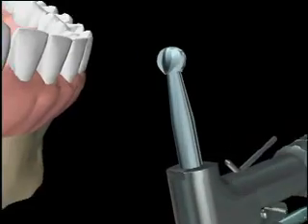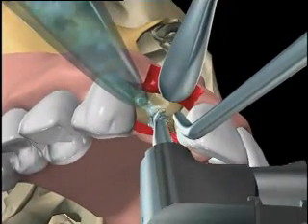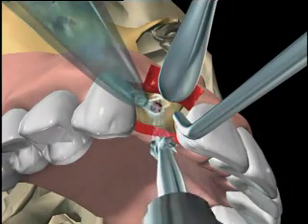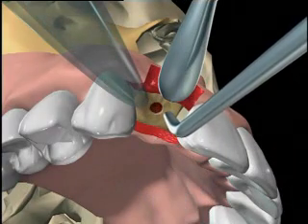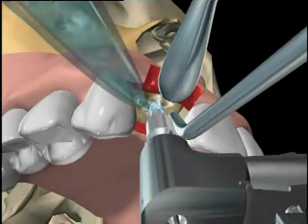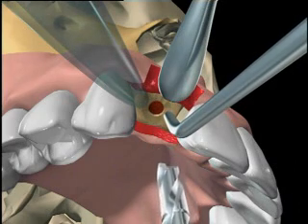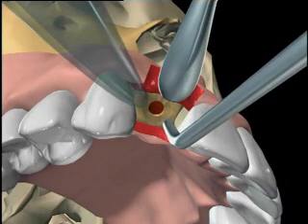A round burr is used to mark the desired location of the osteotomy. External irrigation is used throughout the entire procedure. A 2.3 mm pilot drill is used to excavate the site to its full depth. Drilling at speeds of 600 to 850 revolutions per minute is recommended.